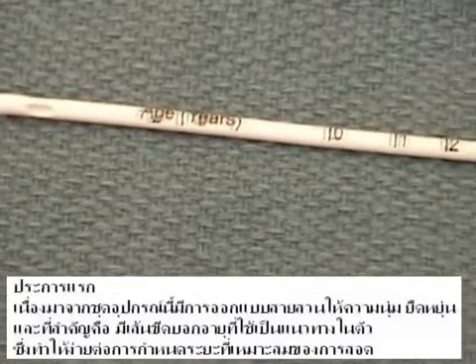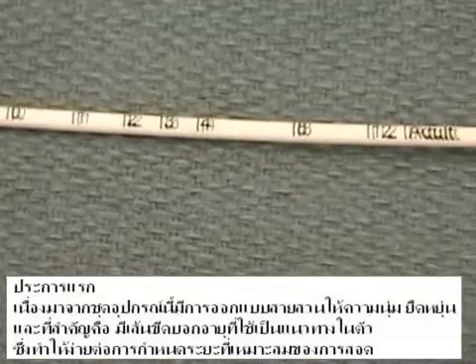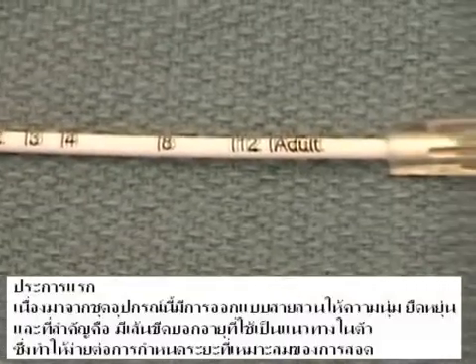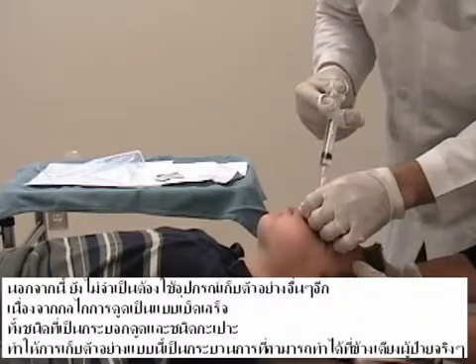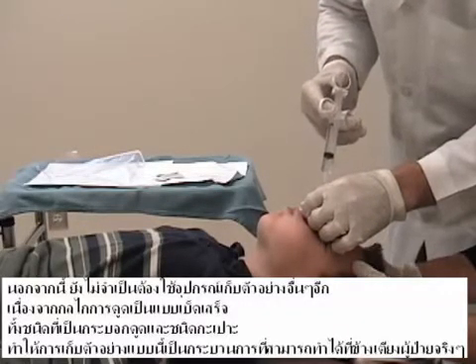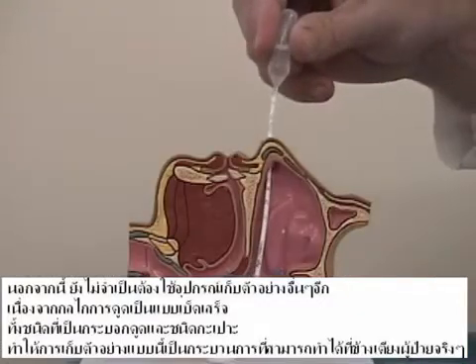This is primarily due to the design of the catheter that is soft, flexible, and essentially self-guiding with age calibrations, making it easy to determine the proper distance of insertion. In addition, no additional external suction is required, as the suction mechanism is self-contained in the syringe and the bulb kit, making this a true bedside procedure.